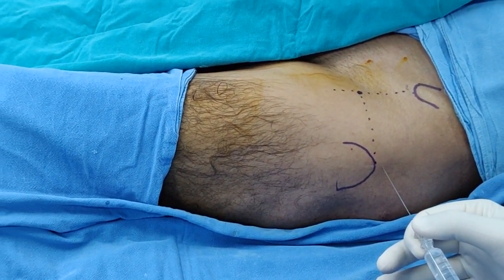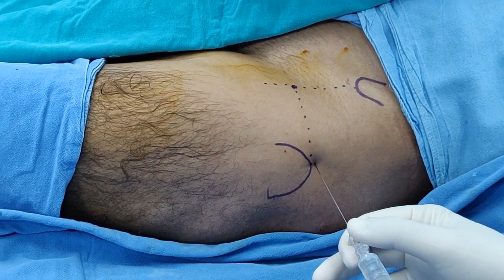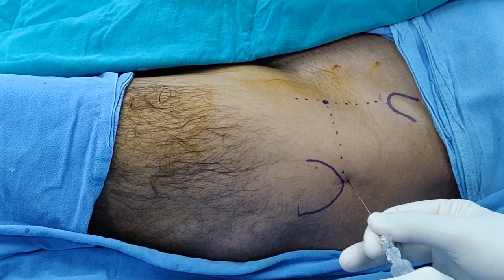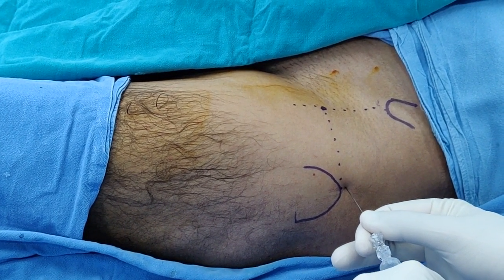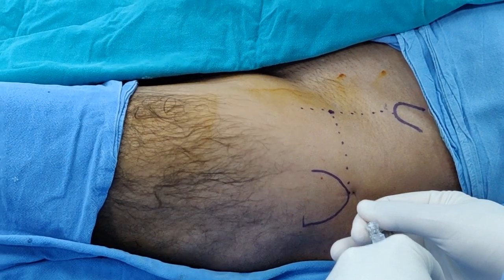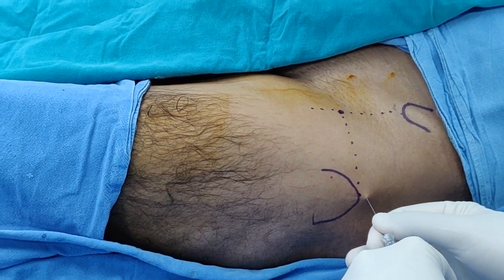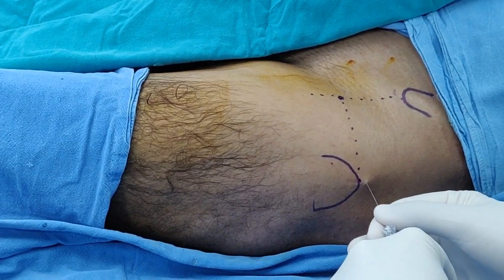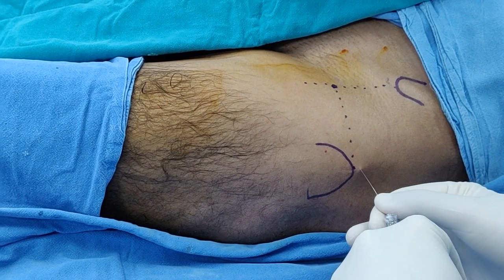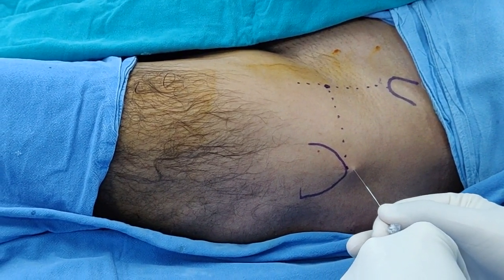First, I inject local anesthetic. We will go roughly a centimeter above the greater trochanter and infiltrate the whole track so that the patient does not feel pain when we are injecting. I use the spinal needle to infiltrate the whole track because sometimes you may require multiple penetrations and you do not want to cause pain to your patient. Now the whole track is infiltrated.